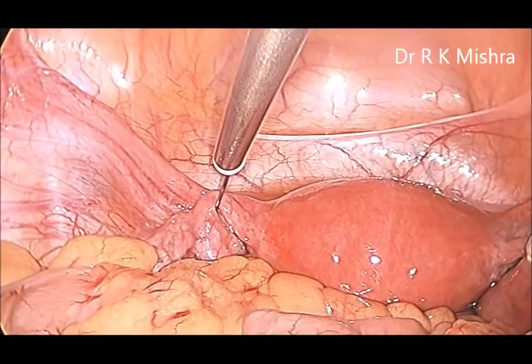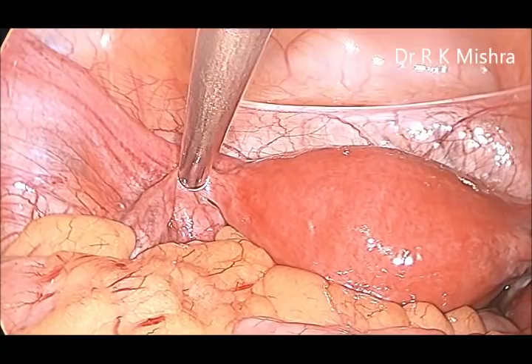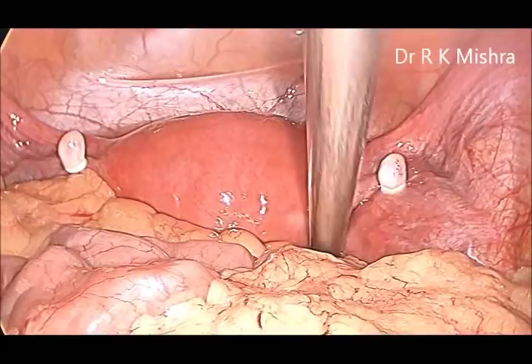Care should be taken that there is no traction, otherwise it will tear from the mesosalpinx and there will be bleeding. Now we can see the tube is ligated on either side with the fallop ring. This is a very safe, economical, and quick way of laparoscopic tubal sterilization. Thank you very much.